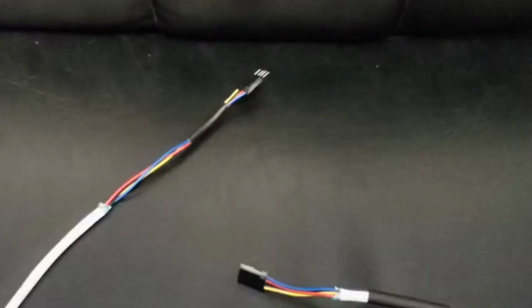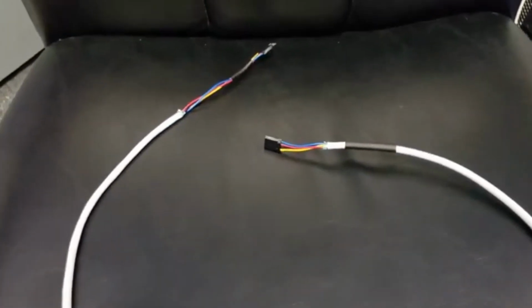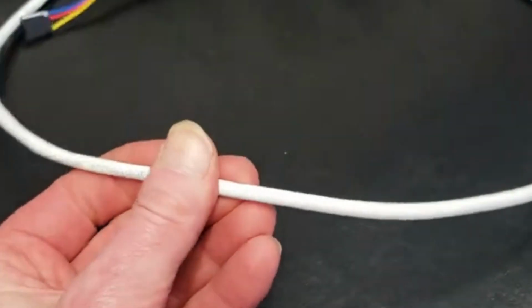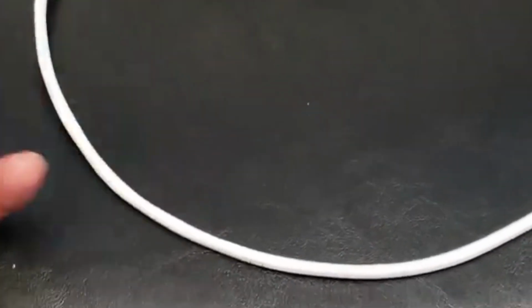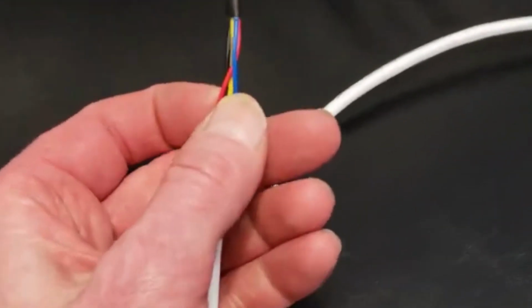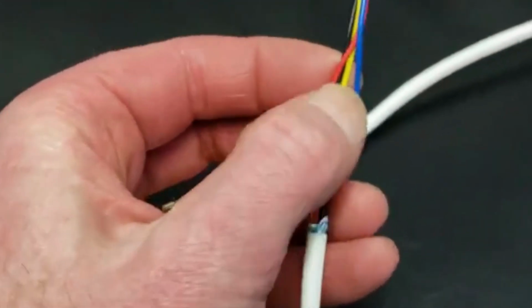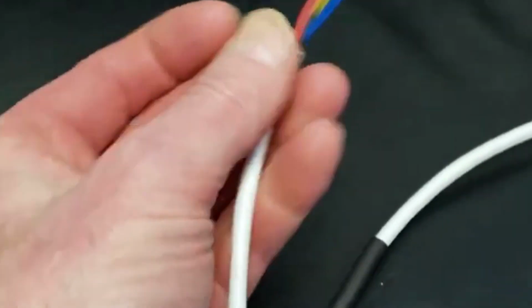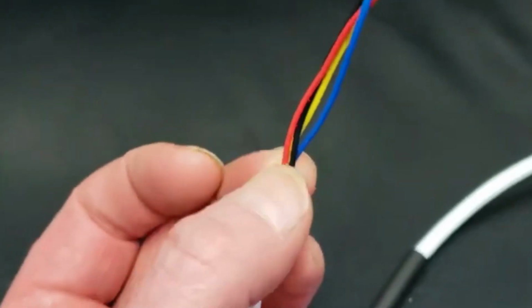Pardon this video again with my cell phone. This is the wire that I made. We're gonna see if it works. I bought like 500 feet of this for 50 bucks. That's all I could find. Places like Home Depot don't have this. I had to get it on Amazon. It's 4 leads, four conductor, and it's shielded, which is the same thing as the existing cable.